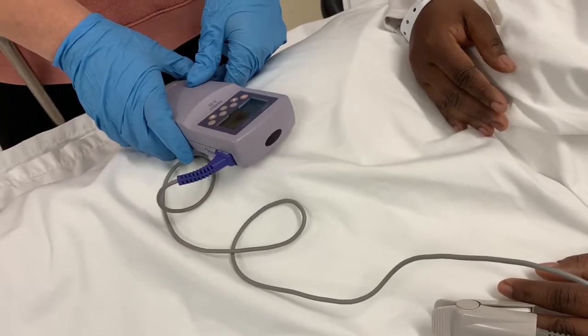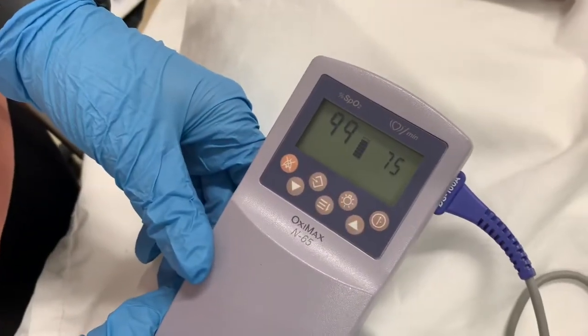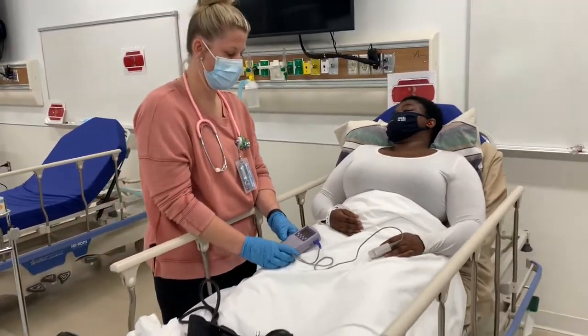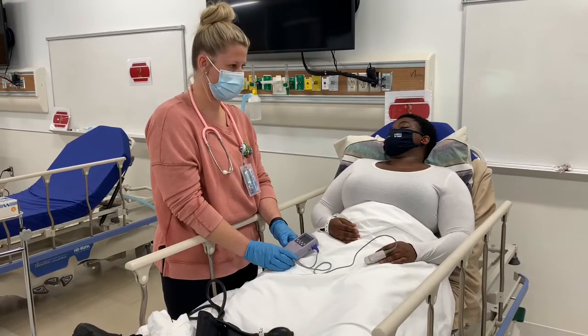Okay. Be sure to correlate your pulse ox values with patient manual heart rate for accuracy. So remember, the heart rate you got when you were feeling for a pulse should be close to the heart rate on the pulse ox.